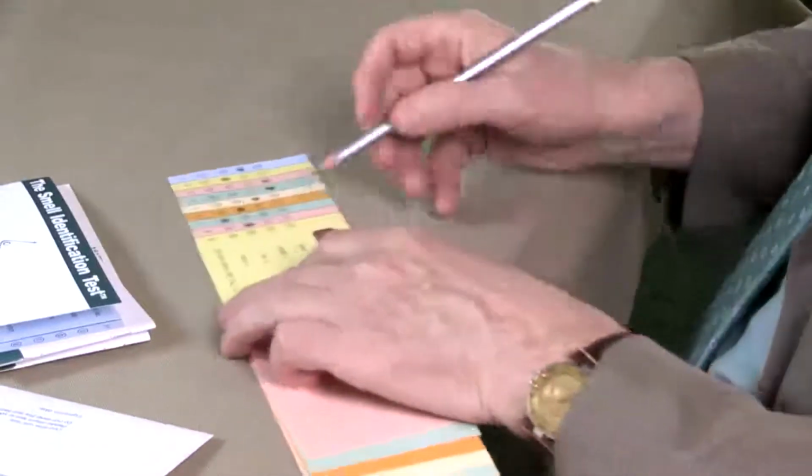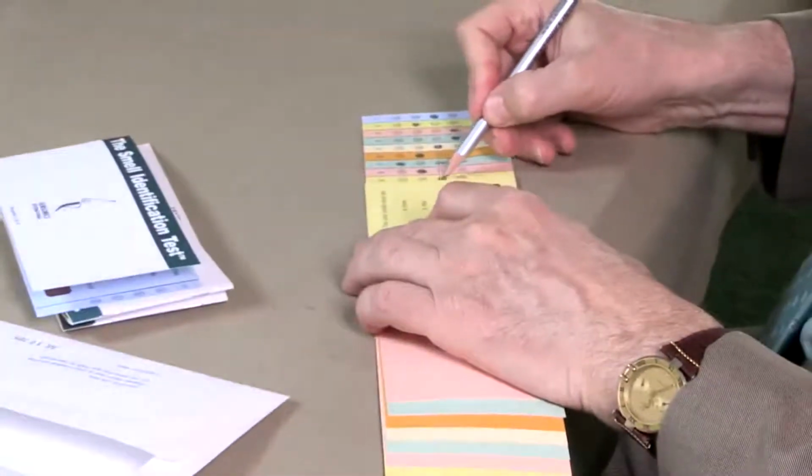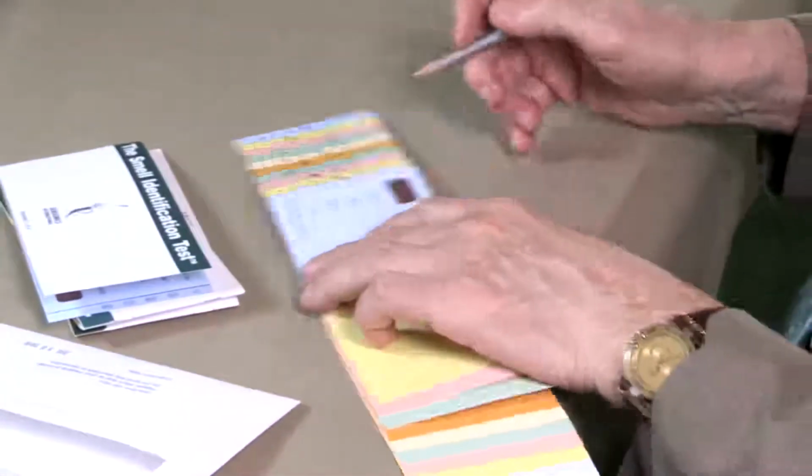Does it smell most like licorice, clove, chili, or banana? Clove. Notice we hold this right up to the nose so you can get a good sniff of the label. Clove, lilac, leather, or apple? Leather. Does it smell like skunk, coconut, cedar, or honey? Coconut. Okay. So we've completed the first of the 4 booklets.